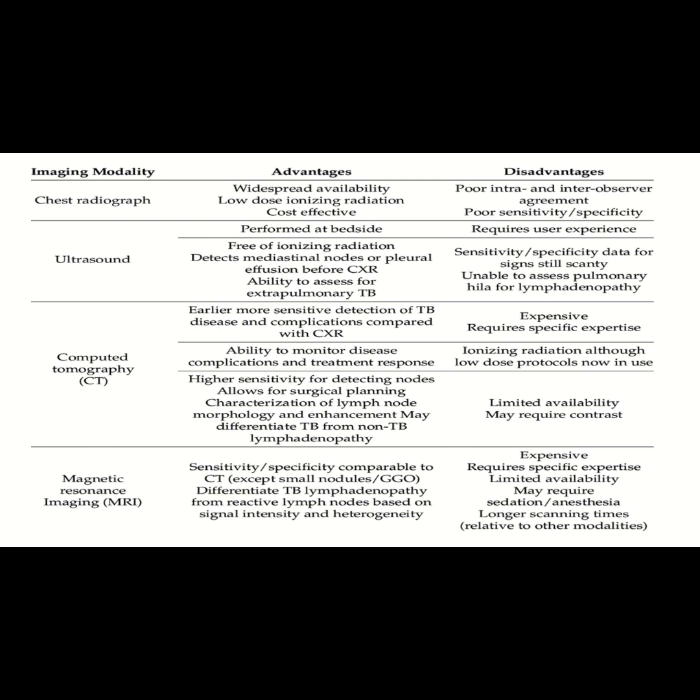There are so many imaging modalities which are used to diagnose any pathology. Chest radiography. X-ray is simply included in chest radiography. Its advantages are very low dose ionizing radiation, cost effective, very cheap, and widespread availability. I mean, it is easily available anywhere. Disadvantages are inter-observer disagreements, poor sensitivity and specificity, because we know chest X-ray is not a detailed scan. This is the basic disadvantage of chest X-ray.